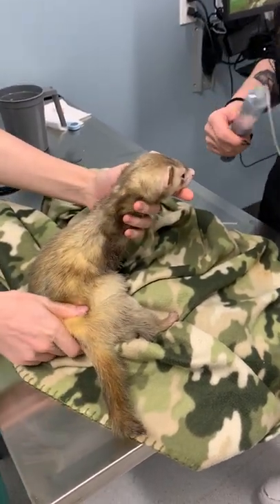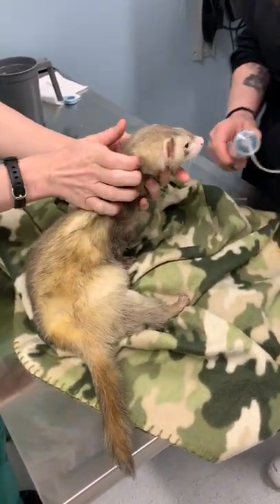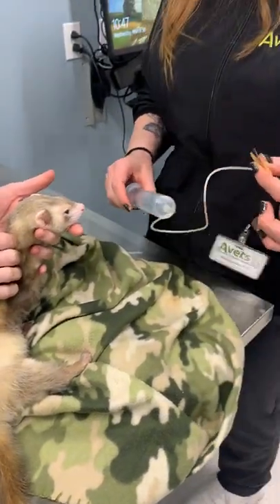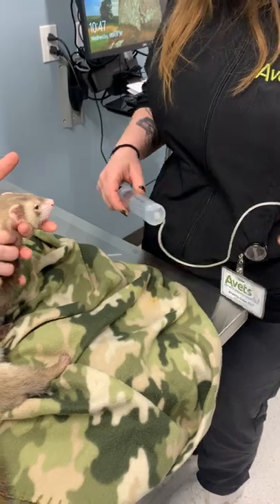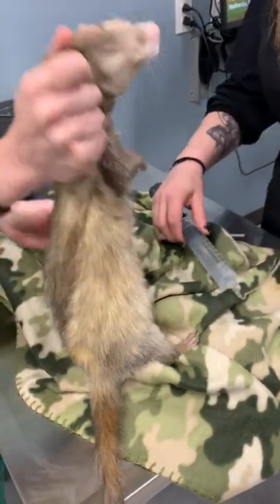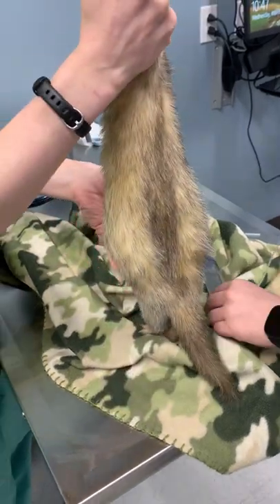We're going to give subcutaneous fluids to our little ferret friend. They've been warmed up initially, and we also place a 19 gauge butterfly to administer them. Dr. Morrison is going to scruff our little friend to help keep them in place because they do love to wiggle.